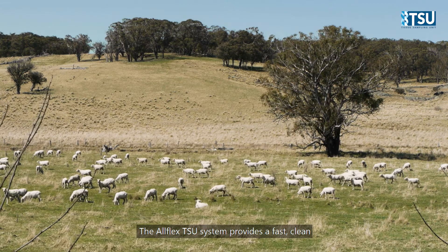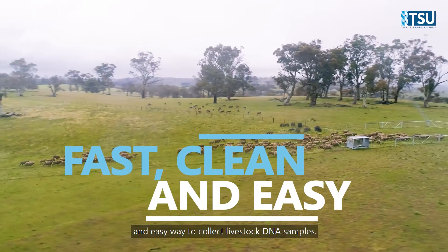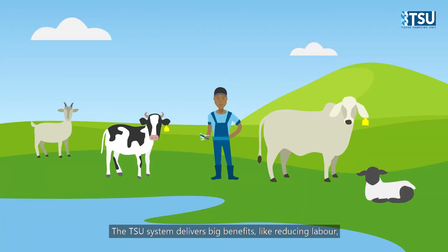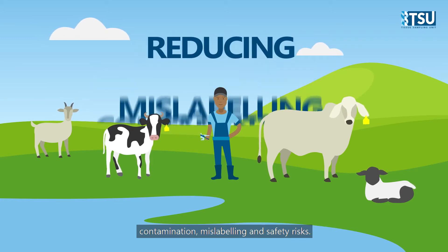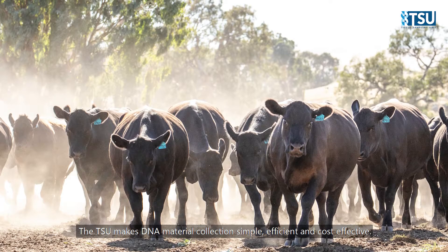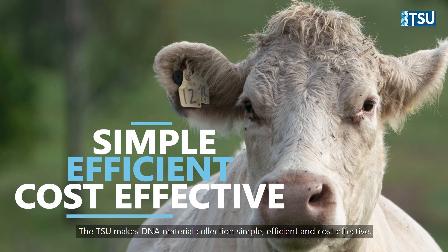The AllFlex TSU system provides a fast, clean and easy way to collect livestock DNA samples. The TSU system delivers big benefits, like reducing labour, contamination, mislabelling and safety risks. The TSU makes DNA material collection simple, efficient and cost effective.